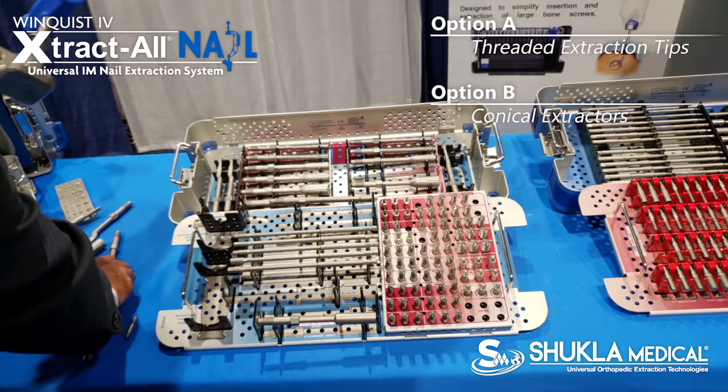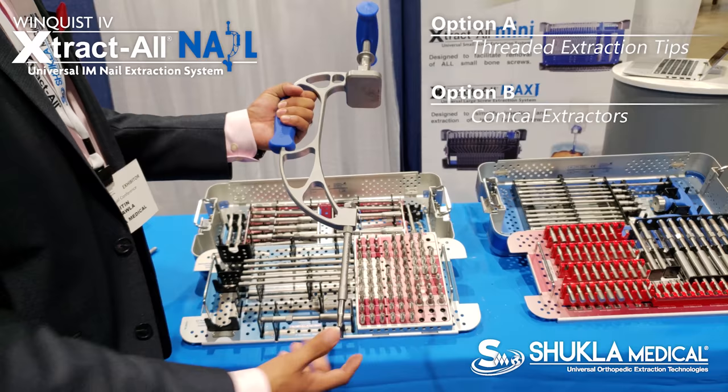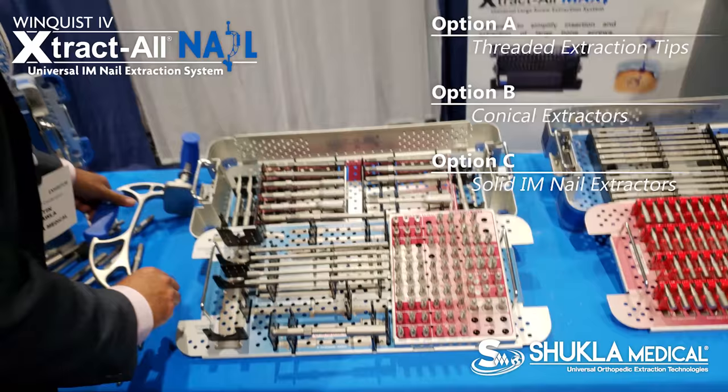Our C-frame has been redesigned to now have a modular T-handle built into it. So then you can put a nut on it and connect the shaft on the bottom, either a threaded extractor or conical extractor.